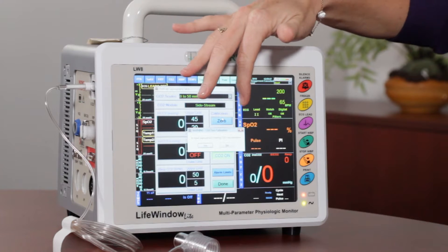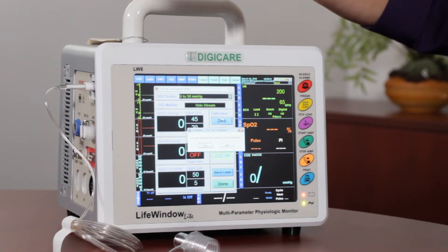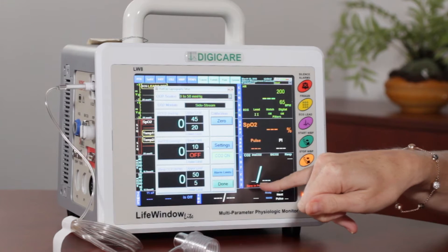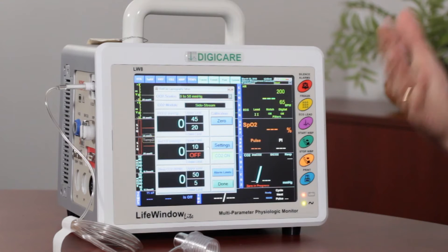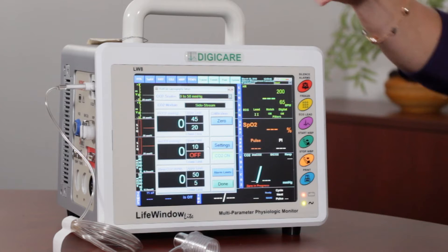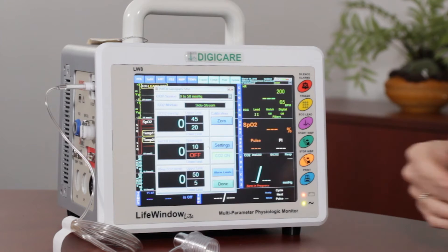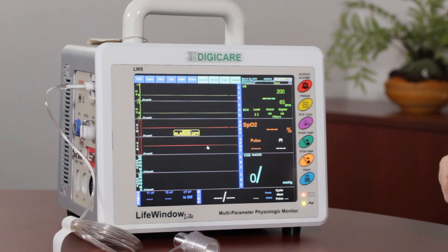It asks "is input exposed to zero?" You just say yes, as long as it's off the patient or in a well ventilated area. So you just hit yes and it's going to run through a zero calibration — it's going to say "zero in progress." If everything is good, what you're going to see is a big red zero that's going to come up, and that's going to give you the indicator that the sample line and or the adapter is good and that everything has been zero calibrated out.